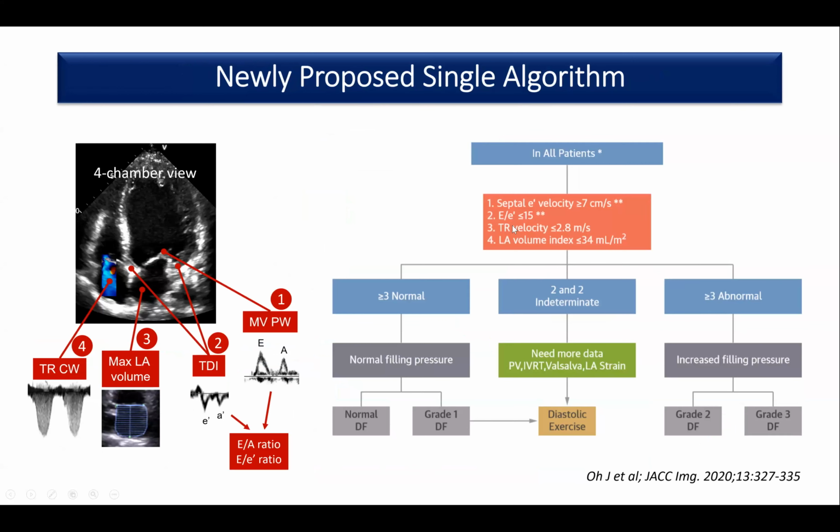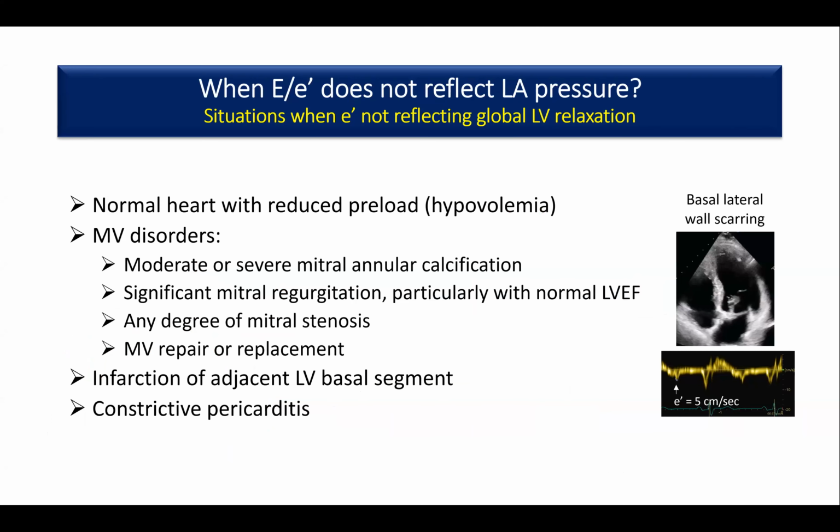Now, there's a newly proposed algorithm by Dr. Jae Oh from Mayo Clinic, which really has only 1 algorithm, not 2. The parameters are pretty similar to what I showed you from the guideline. I mean, you can read it. I don't think it makes a huge difference.